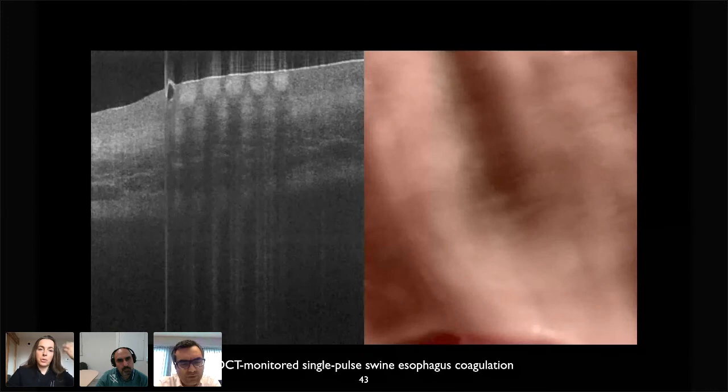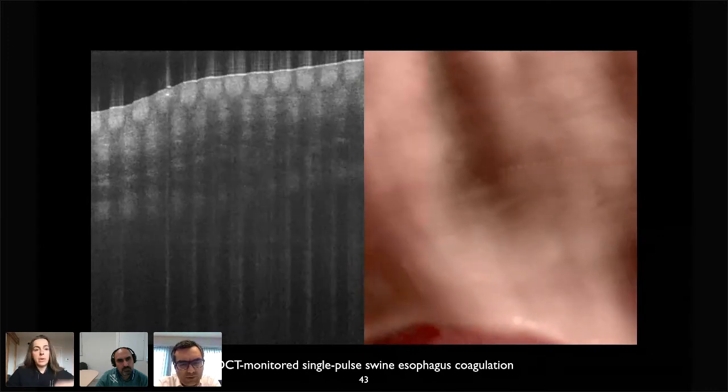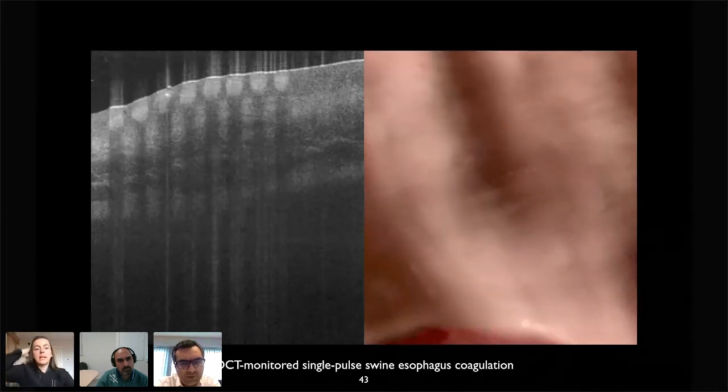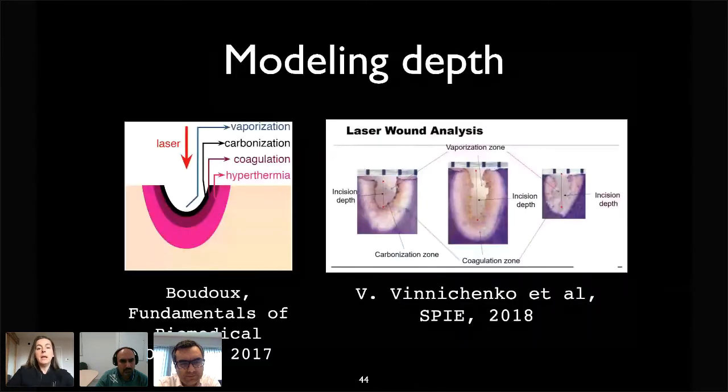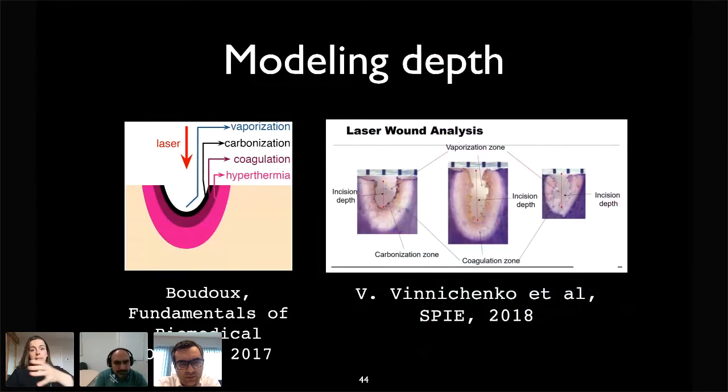But this is through new fibers, and we have a project supported by Transmedtech, supporting Edith Duchamp, who's working on these new fibers here. So we're modeling the depth. We're trying to not just go blindly and shoot at stuff with a laser, but to be able to have an absolutely controlled wound, depth of wound without carbonization, just being able to ablate very cleanly.